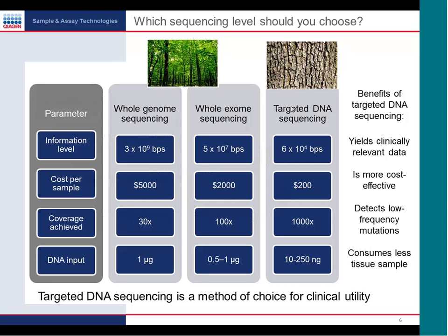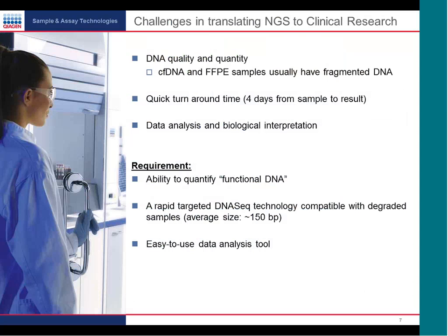And obviously, in the clinical setting the samples are going to be very precious, and targeted DNA sequencing needs only a very low DNA input, ranging from 10 to 250 nanogram. So taken together, we can say that targeted DNA sequencing is the best choice for clinical utility. Targeted DNA sequencing has been available in the market for quite some time. It's not new at all.